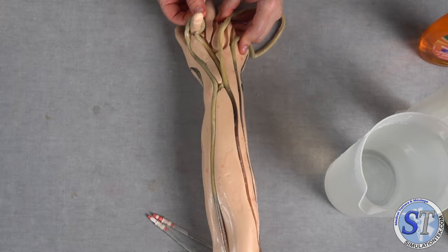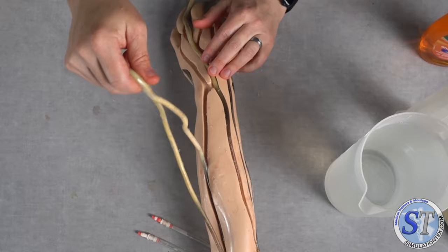And I'm probably going to be using some of this video that we're shooting to remember how to put this tubing back. We'll test me later. So that one there just went around and back. That one there went like that. And just be careful because some of these parts are real thin and you could break it forever.